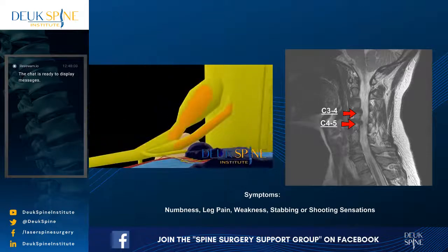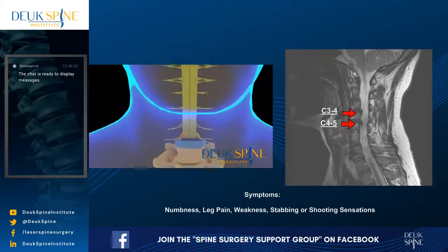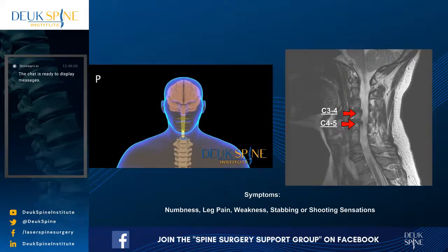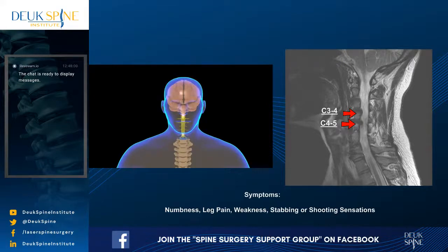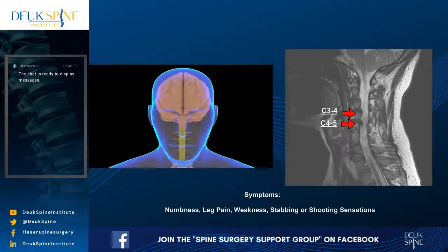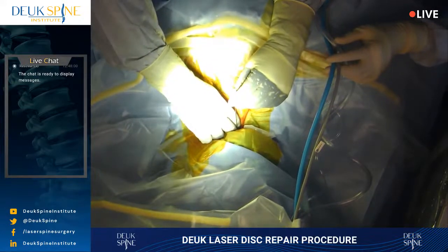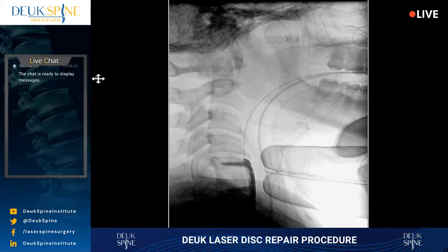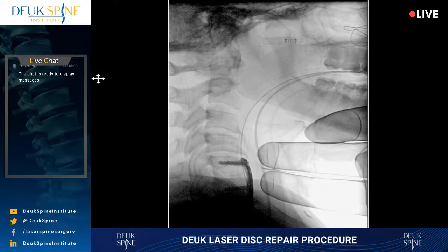All right, so our patient's asleep and intubated, and like I said, they've had a fusion already done at 5, 6, and 6, 7. I can actually feel the metal plate right now, and I gotta be above the metal plate. All right. So I'm working my way up to gain access to her spine.